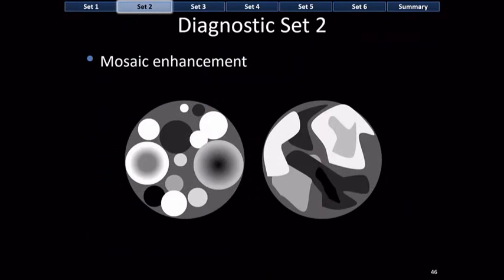Diagnostic set number two is mosaic enhancement — nodules composed of inner nodules or inner compartments. These inner nodules or compartments are distributed randomly, with no rhyme or reason for their size or location. When you see random intranodular nodularity and compartmentalization, think mosaic enhancement.